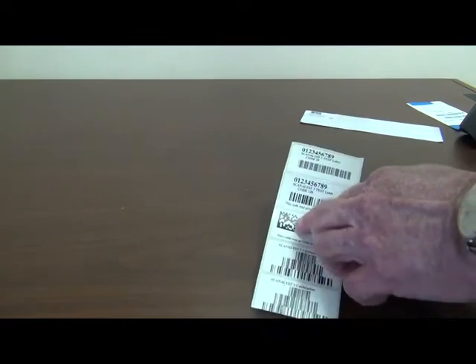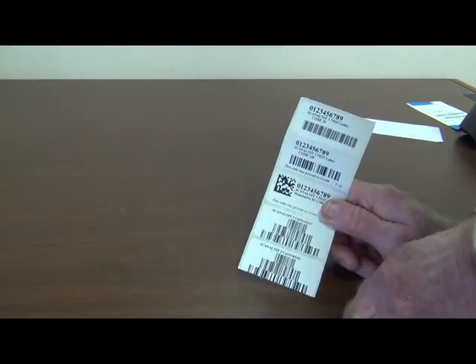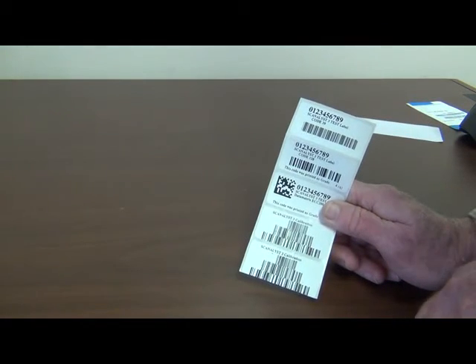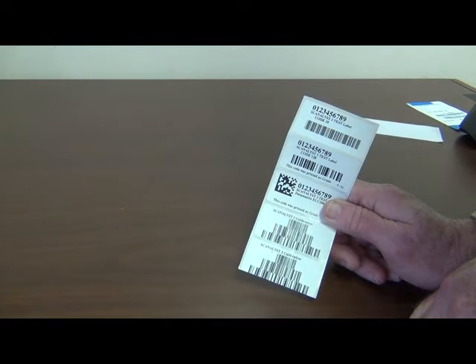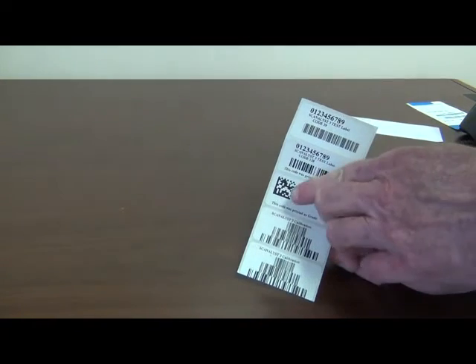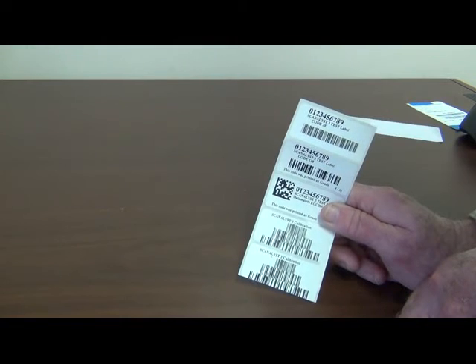About two-dimensional barcodes, these have a built-in redundancy, whereas a linear barcode can be destroyed by a crease and stuff like that, but a 2D barcode has redundancy that can correct some of those types of problems. And in healthcare, we're using Data Matrix ECC 200, which is the error correction coefficient that gives us about 25 to 30% redundancy. That means that some of these dots in the middle can be obliterated, scratched off, and it'll still read fine.